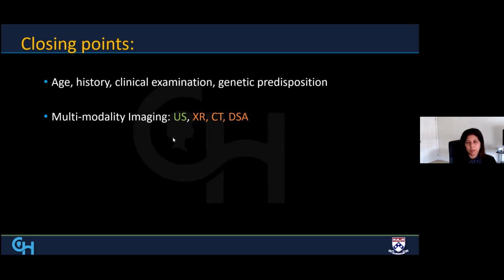And sometimes ultrasound is accessible if it is a superficial lesion. Radiographs are less common. CT scan, and sometimes we need to use the MR. Of course, I've just not listed it here because these are the ones with radiation, and you can sometimes need angiography. MR is the gold standard in most of these soft tissue neoplasms of the head and neck. And you make use of the different characteristics on the sequences.